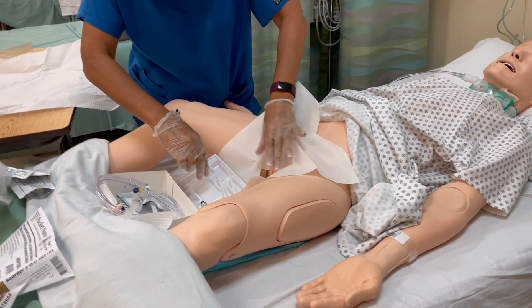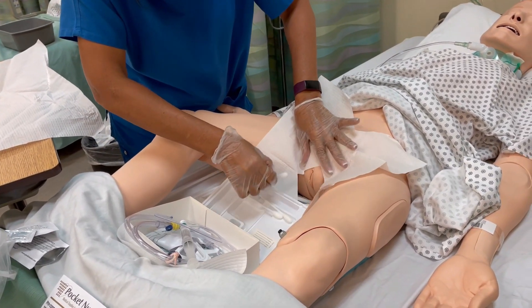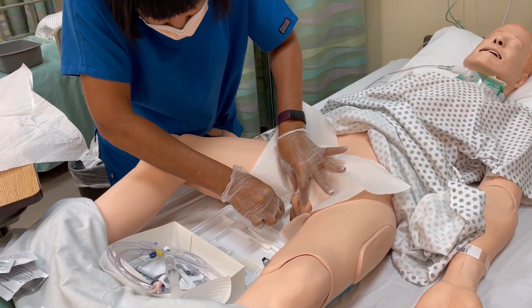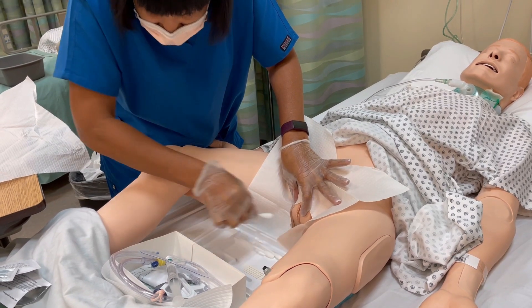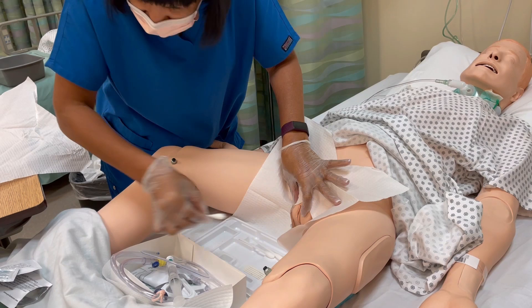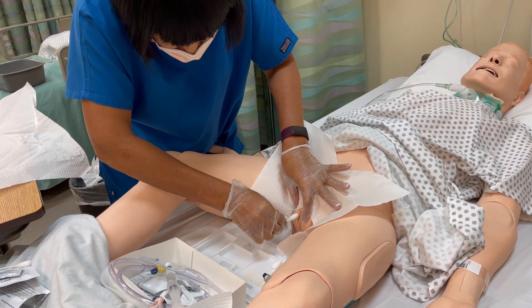Ms. Selena, are you ready for me? I'm going to wipe it — you may feel something cold. So I'm holding it back. Start from here — very good, wipe down. Here's mistake number nine: she cleaned with the sterile swab and then carried the now contaminated swab back across her sterile field. She continues to do that two more times.